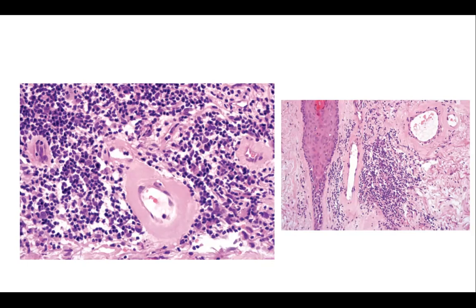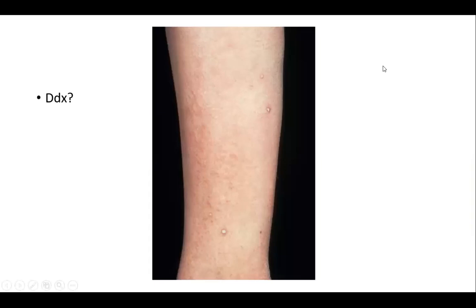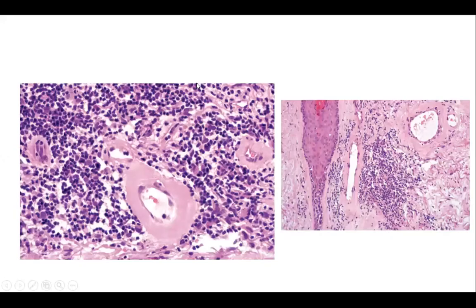If you can look back at the clinical, you can see the hypopigmented pearly atrophic lesions. I don't know why I lost the image here. There's supposed to be an image here that's closer. And then you've got your lymphocytic vasculitis here, you can see. I do understand why you guys think of collagenous vasculopathy and livedoid vasculopathy, because you saw the thickened vessel wall. But don't fail to notice the lymphocytic inflammation around the blood vessels. So this is a case of Degos.